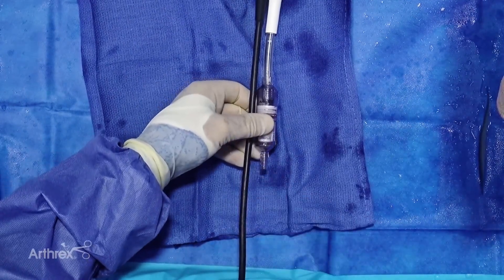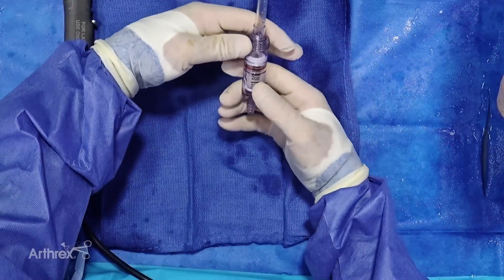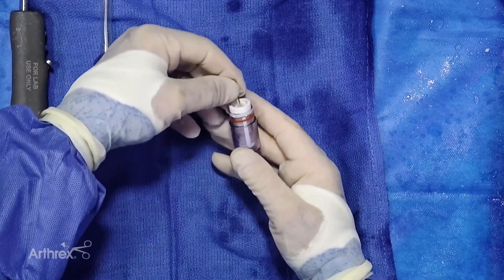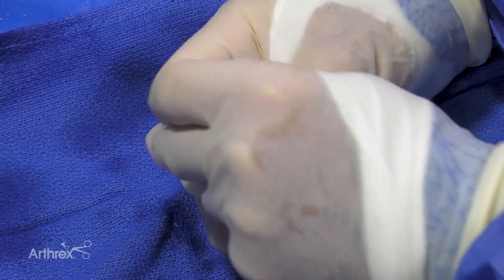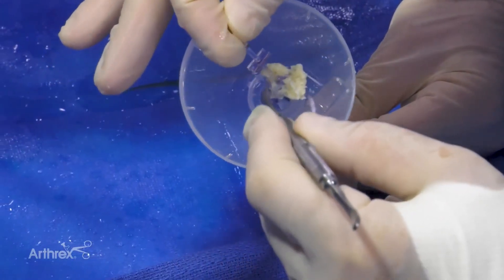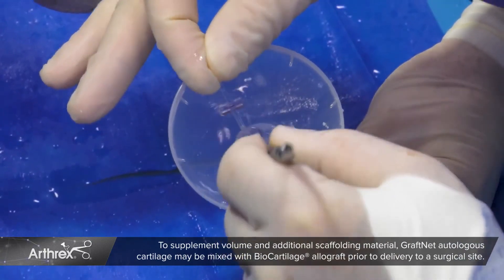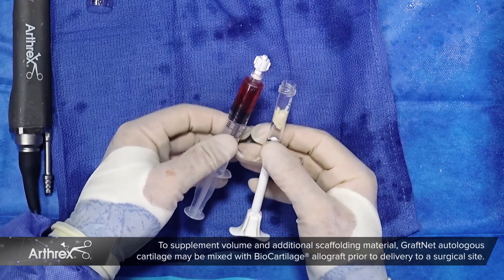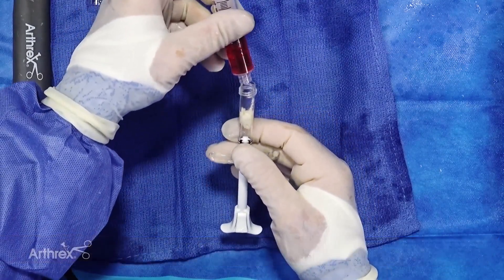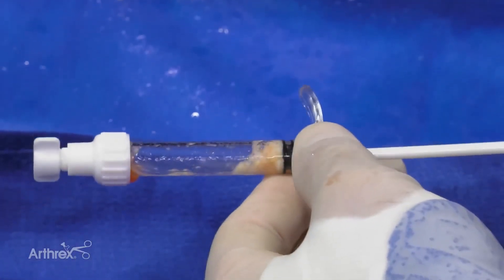Next, we'll disconnect the suction from the system, then disconnect the graft net from the shaver, and uncouple the housing of the graft net. You can see visually that we've got about two cc's of articular cartilage autograft. We'll pull out the T-handled plunger with the articular cartilage in place. Using a freer elevator, we'll place it into our mixing syringe toward the base to make it easy to load. We'll hydrate this with autologous fluid — PRP or bone marrow concentrate — to improve consistency and act as a carrier for inductive material. We'll mix this to get a homogeneous mixture, much like we do with biocartilage.